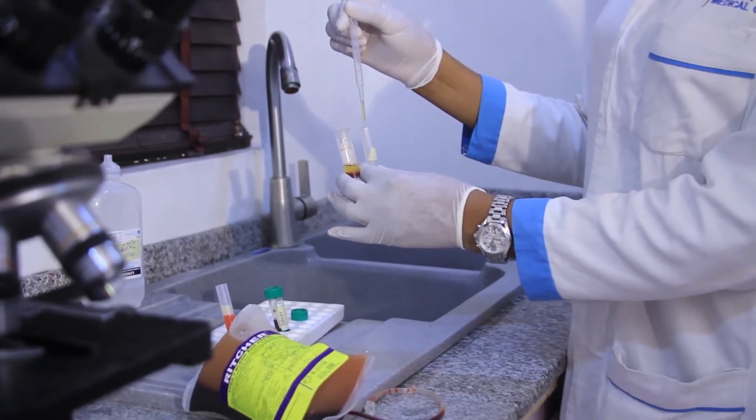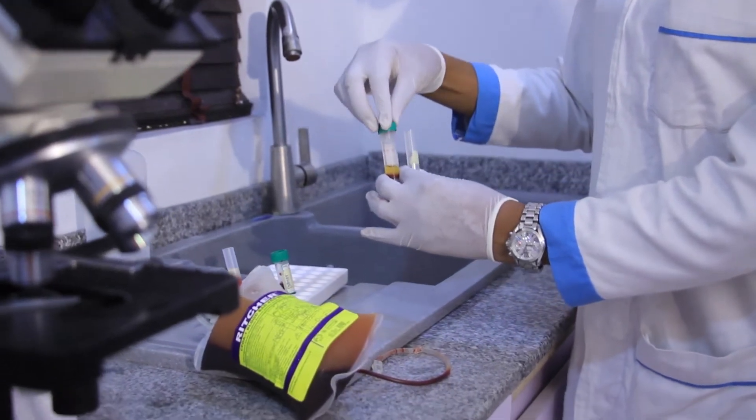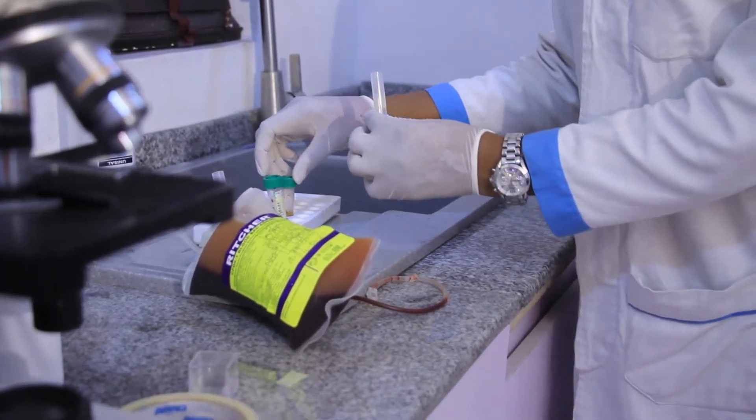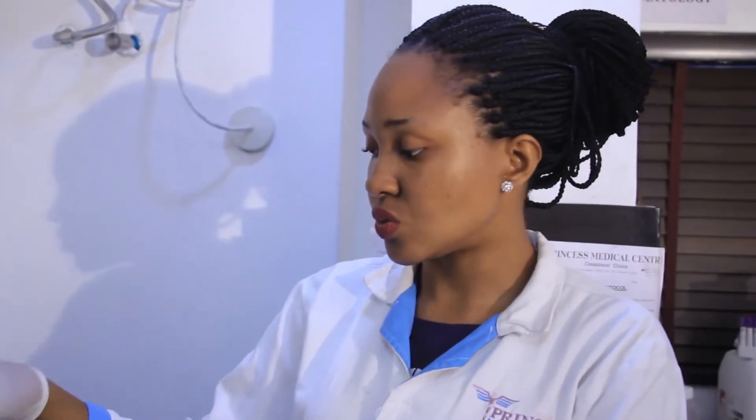Remember: equal volume of the donor's washed red blood cell and equal volume of the recipient's plasma. So we'll be adding 2 drops. Cover this. Afterwards, we'll mix it properly. We're going to place this into the centrifuge at 3500 RPM for 3 minutes.